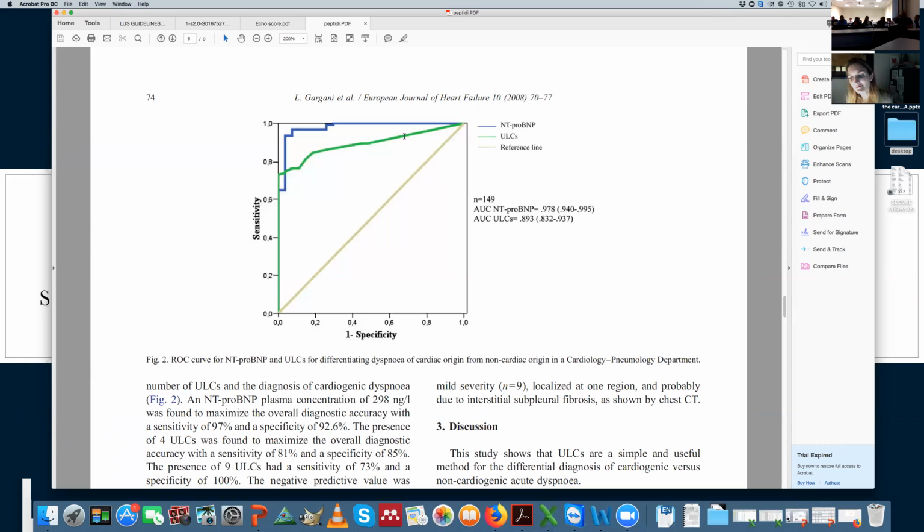Okay, thank you. Maybe you will have patients with hemodynamic congestion, and these patients don't necessarily have pulmonary congestion, and you have written a lot on this specific topic to differentiate between hemodynamic congestion versus pulmonary congestion. And the patients who have pulmonary congestion, the prognosis is worse. Exactly. It's worse.